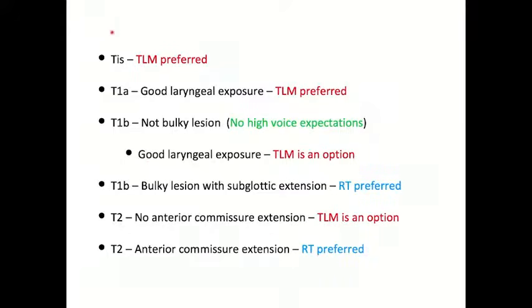My own close friend, a classmate, we would have debates, but when his dad had a vocal cord cancer, he referred him for laser surgery. He came to the operating theater, he saw, luckily the dad is doing fine, and I have gained his confidence as well. So finally, to conclude, for a carcinoma in situ, a T1A, there is no debate. Laser surgery is the better treatment option.